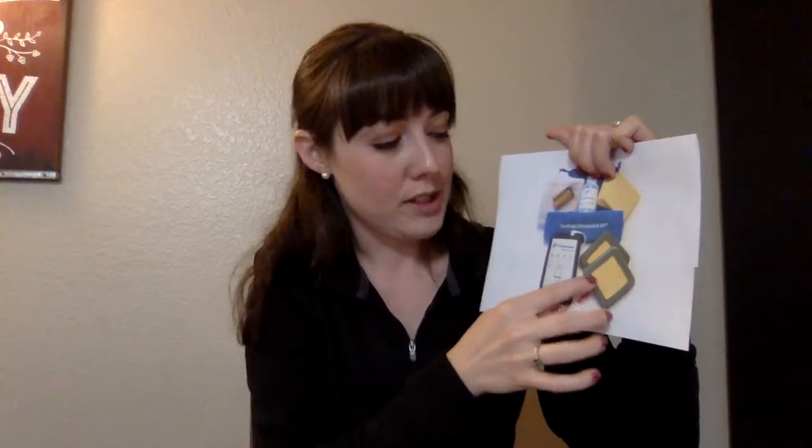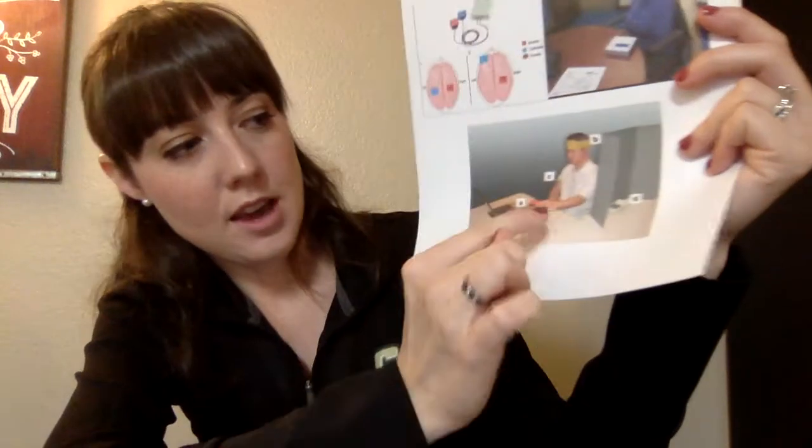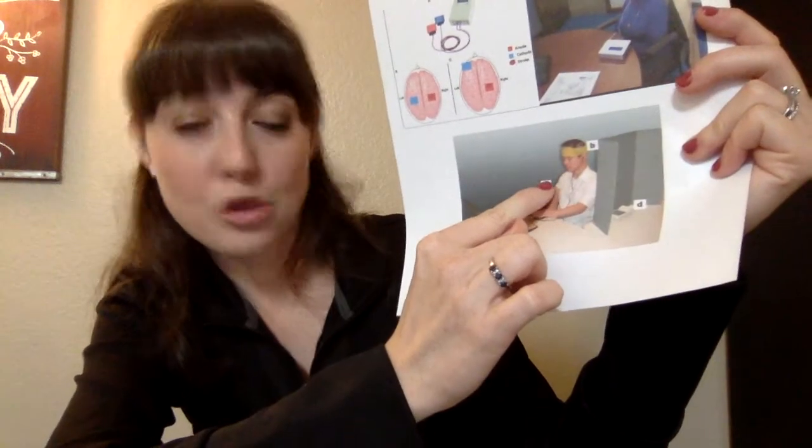So for the purpose of my example, this red anode electrode would go straight to the left frontal cortex, whereas the black cathode, the inhibiting or negative one, would go on the contralateral shoulder, which is the right. So in this example, this is the anode on his head, and then this is the cathode on his shoulder or arm.